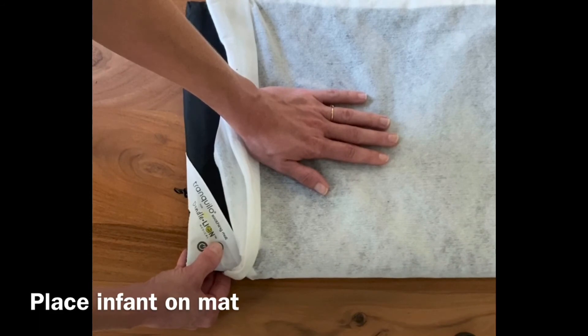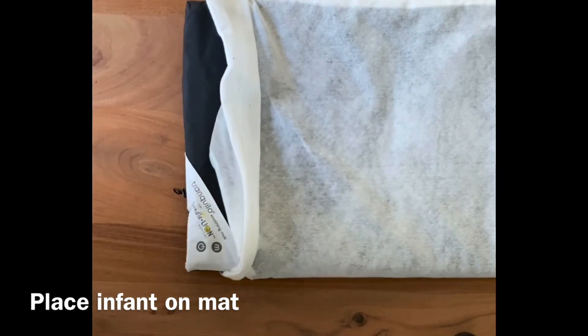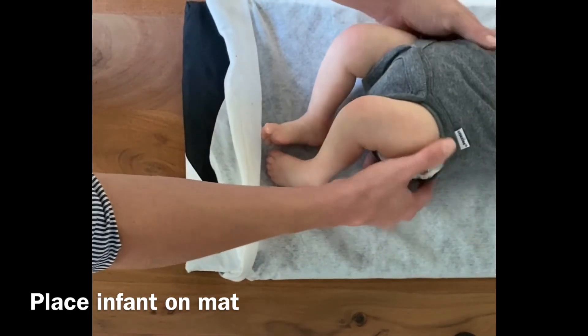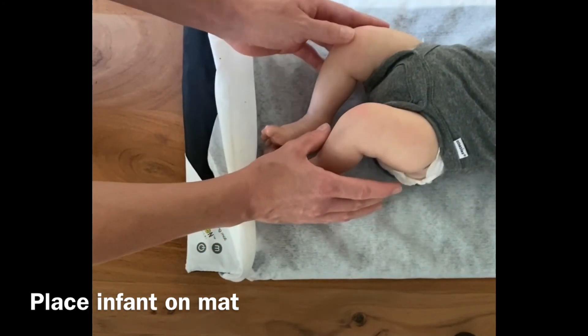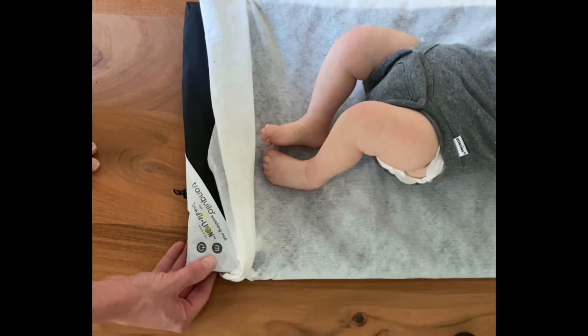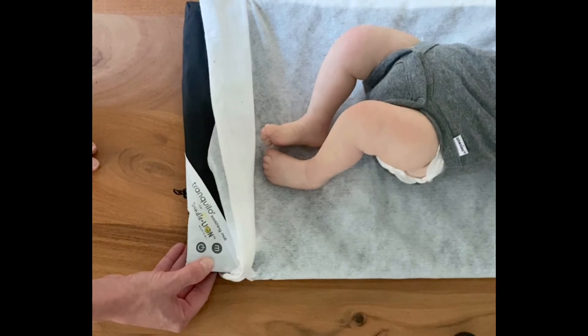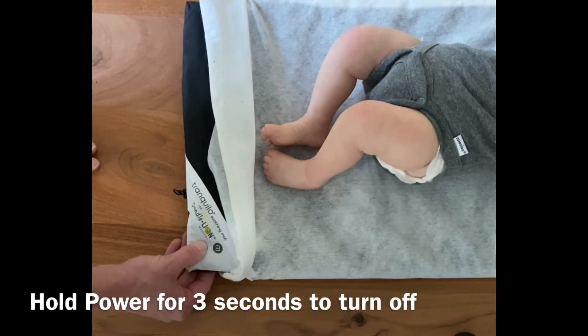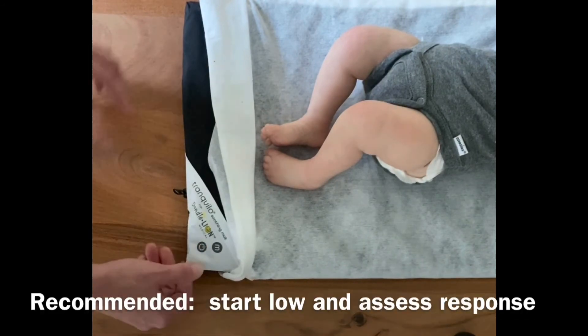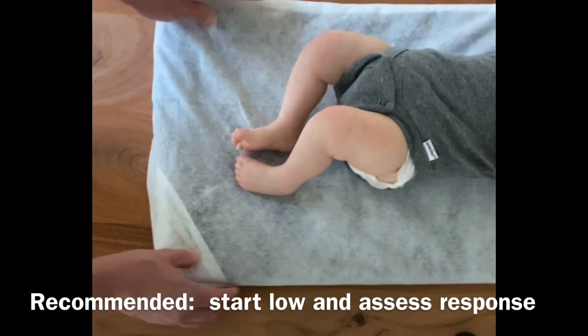Once you've determined the mode that you intend to use for your patient, place your infant on top of the mat. When the baby has calmed, it's appropriate to turn off the mat. It is generally not appropriate to leave the mat on at all times because it can provide an inappropriate level of stimulation for the baby. If you're not using the automatic off function, you can turn it off manually by pressing and holding the power button for three seconds. As a general rule, it's advisable to start with a low level of vibration and assess the baby's response to the vibration pattern.